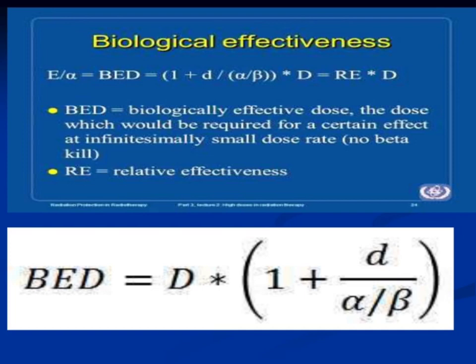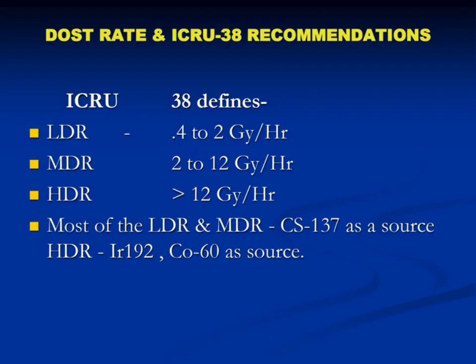Since carcinoma cervix is heavily involved with brachytherapy, the ICRU 38 recommendation is given. The treatment technique must be described. The reference volume should be described in terms of the height, width, and thickness of the volume enclosed by the 60 gray isodose for LDR treatment in carcinoma cervix.